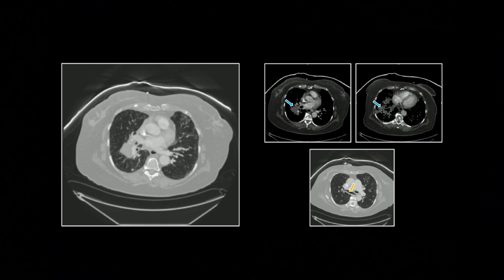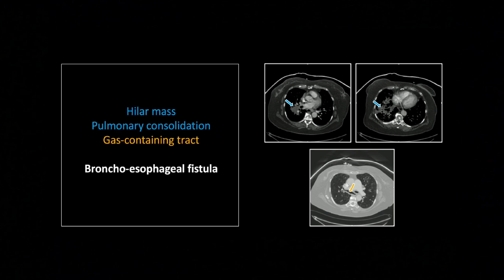Always a reasonable question. All right, so that is a bronchoesophageal fistula.